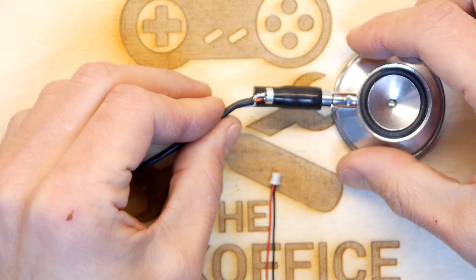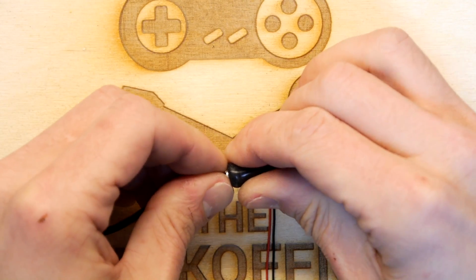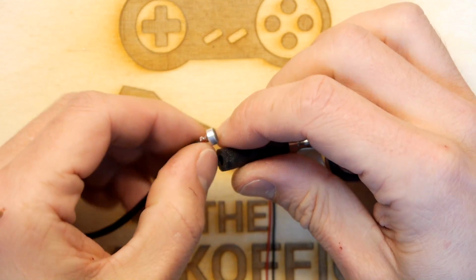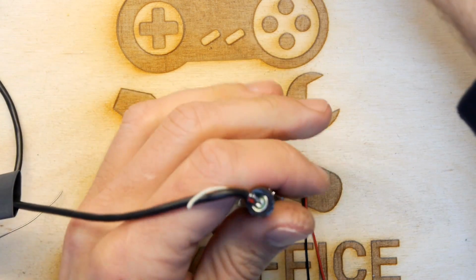Really, you could probably push that in and then inject some hot glue as well if you wanted to make that super strong and super permanent. I might do that if and when it ever breaks. I certainly don't want to do it just yet, because it just might not work, and then that will be a big problem for me. Or I might later decide I want to hook that second channel up.